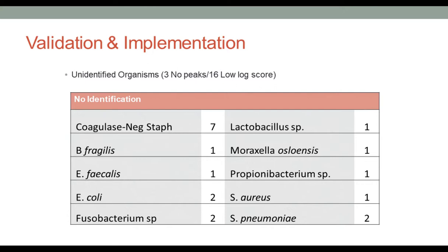I'm not sure what they mean by false positive results, but we haven't found that it's given us organisms that were giving us wrong information, if that's what the question was. We know that we're not going to pick up everything because of sometimes the technique of the technologists or these low bacteremias, but we haven't really found anything where I consider a false positive result.